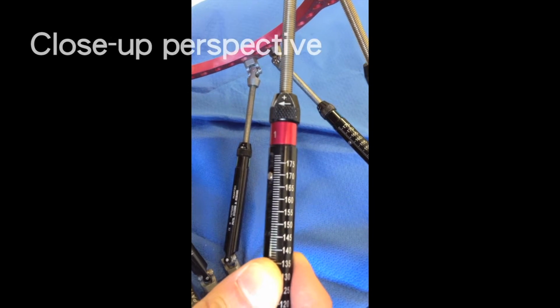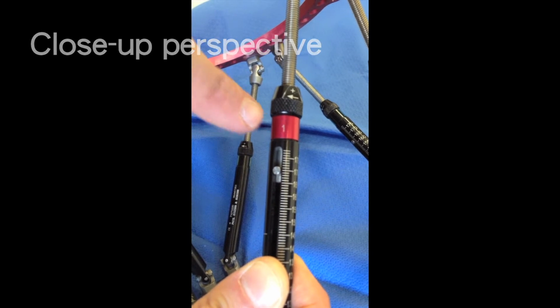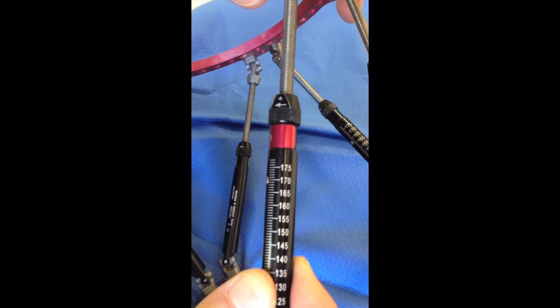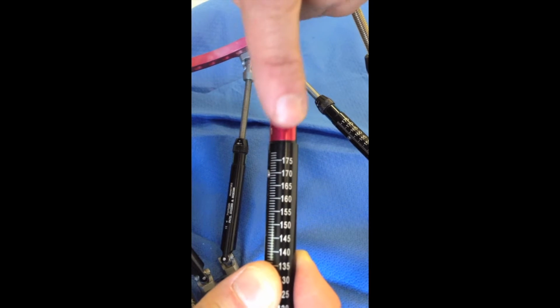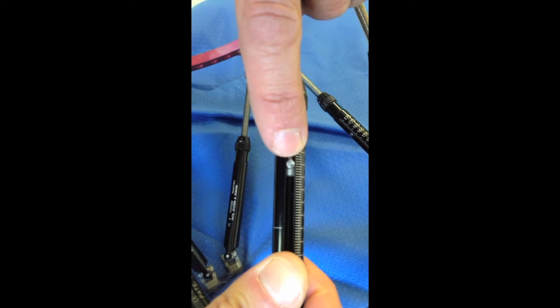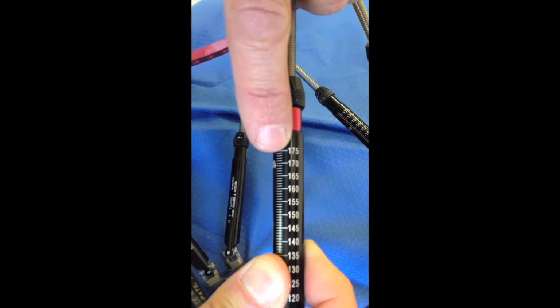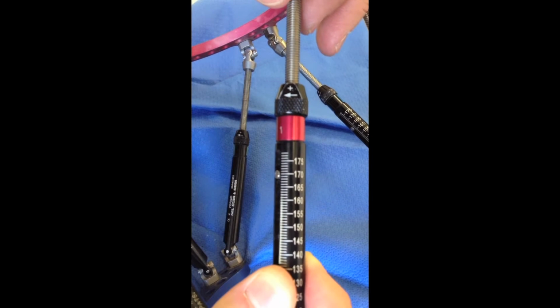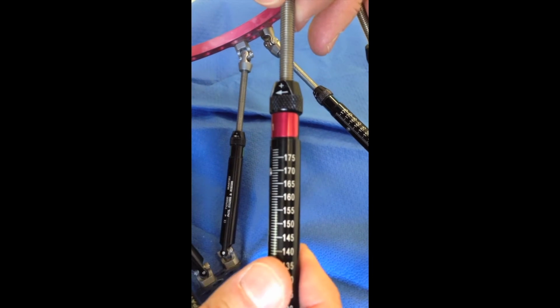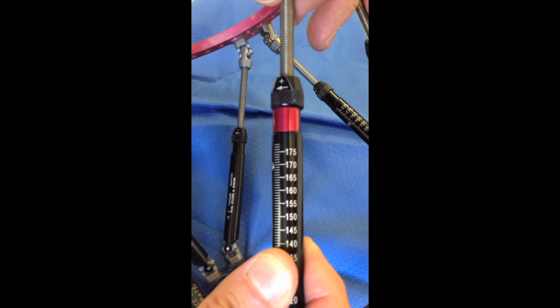So this strut, which is strut number 1, as you can see from the 1 there, is currently on 170. So 170 is there, and you can see the metal ball with the notch in it is lining up with 170. So we look at our schedule. Our schedule will tell us we want to go to 171. So how do I do that?